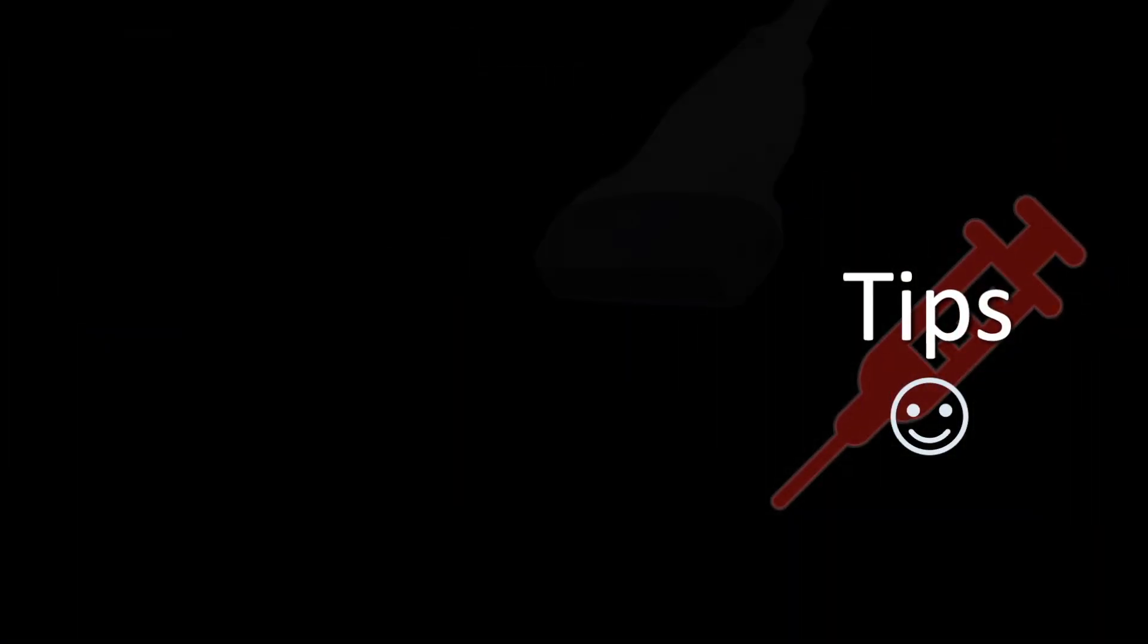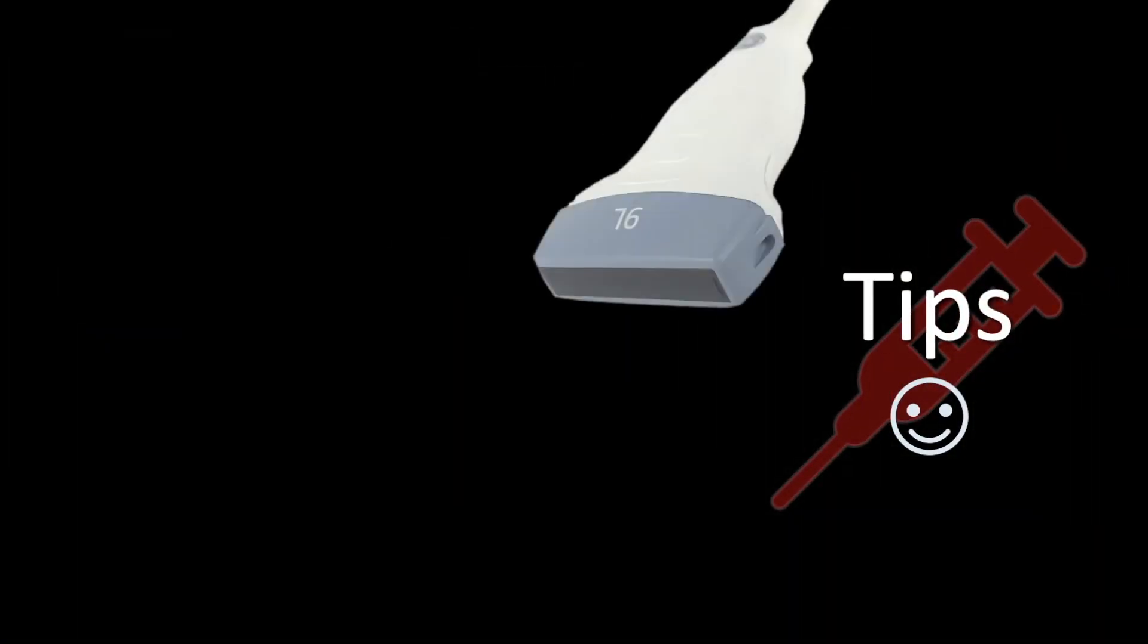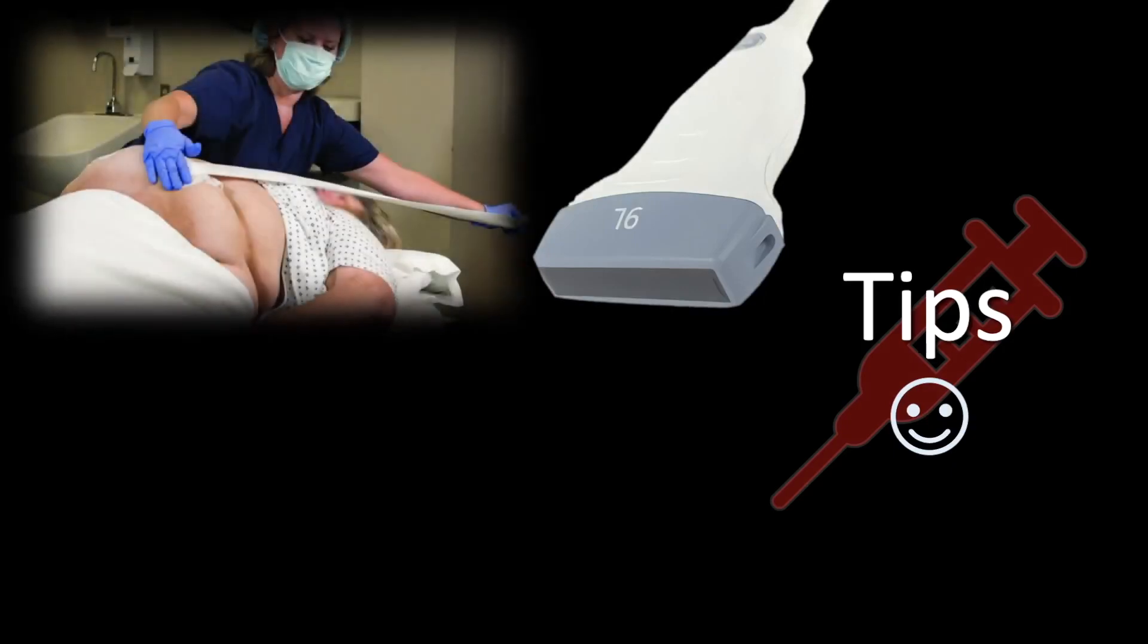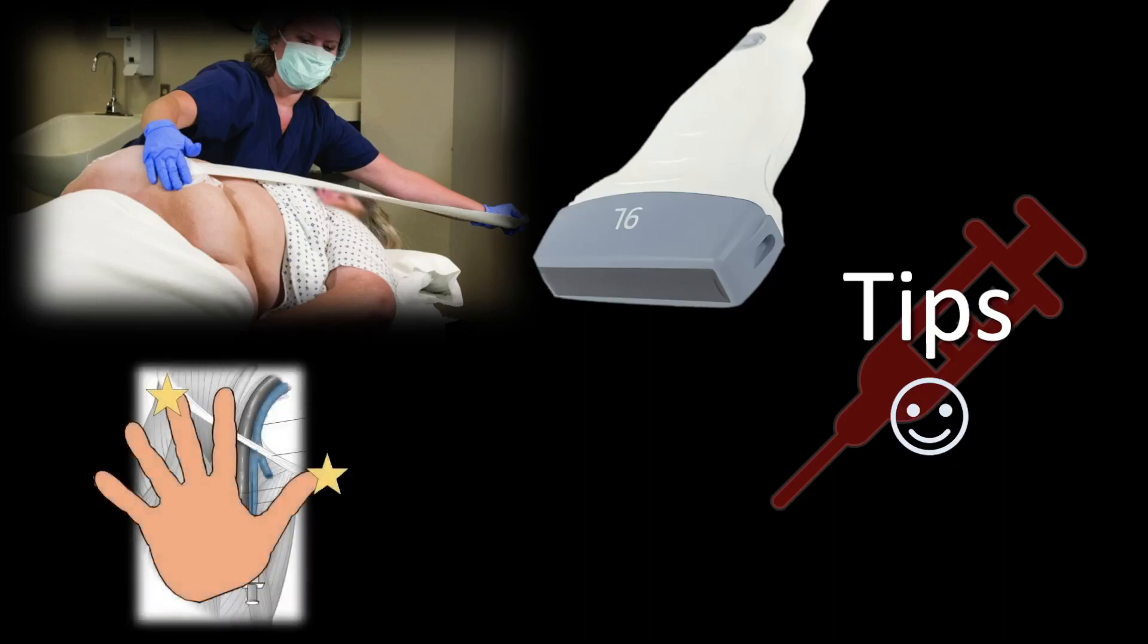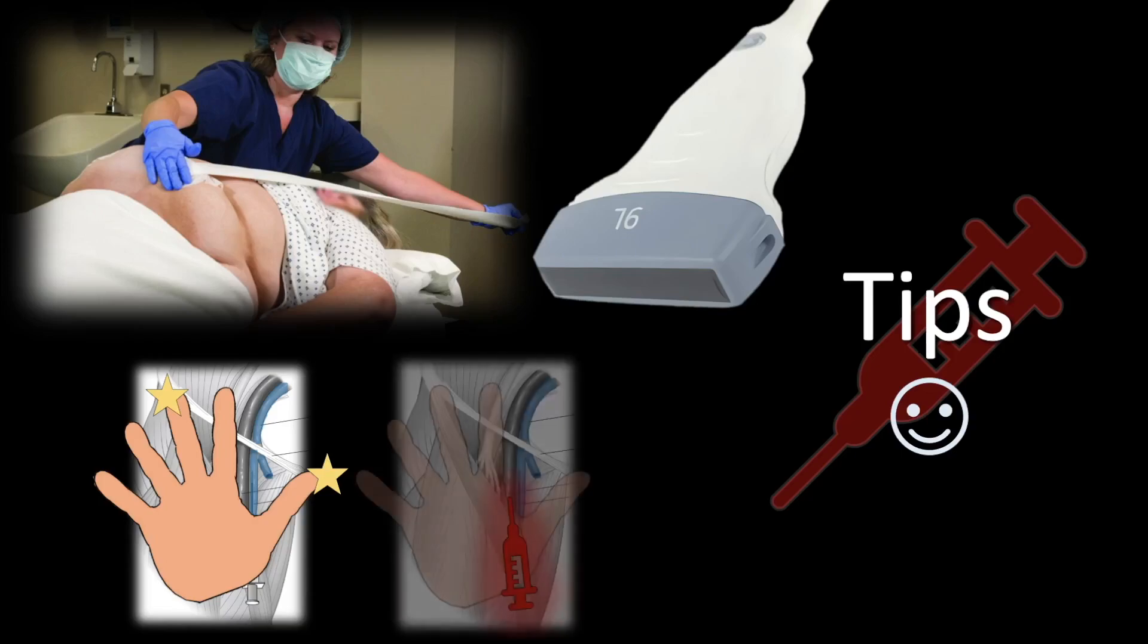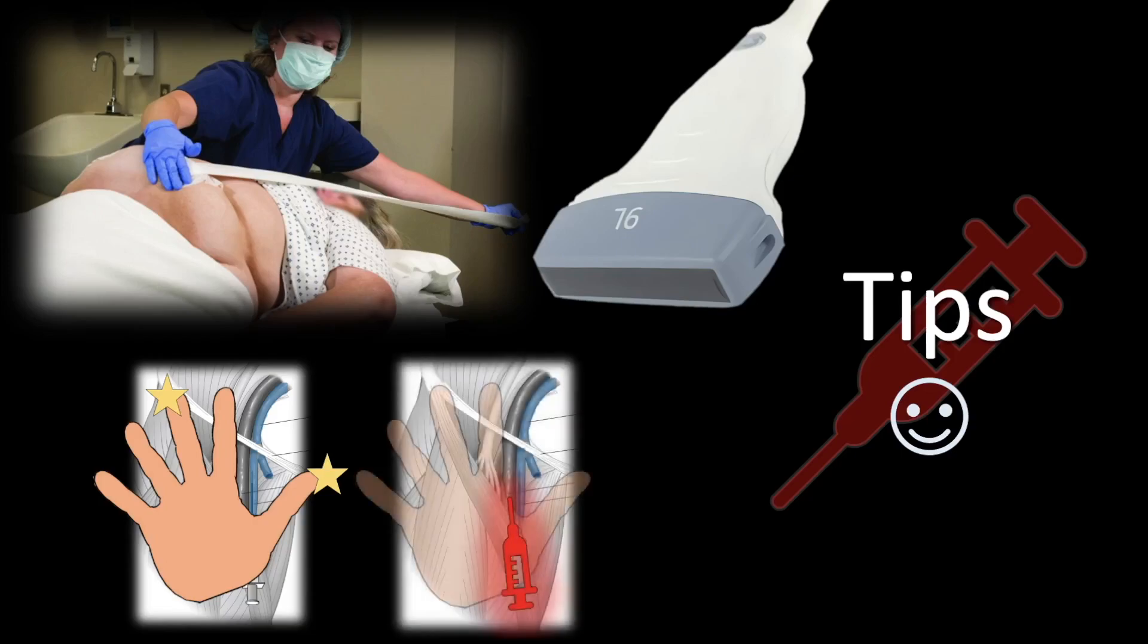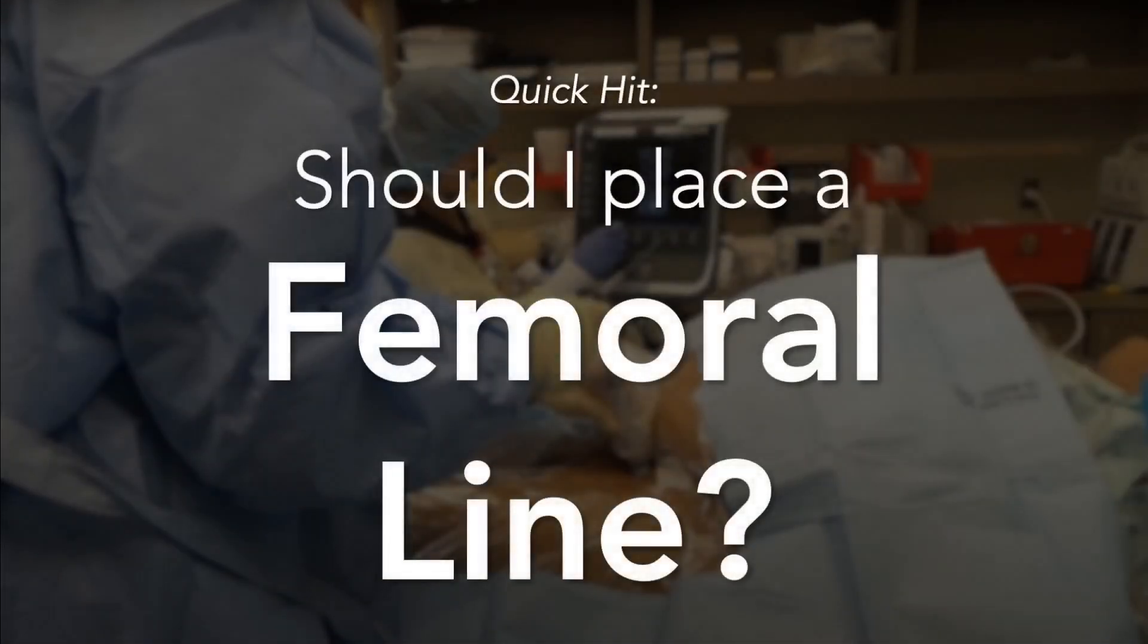And last, remember our four tips that we went over. If you've got the ultrasound nearby, just use it. Remember, it can be really tough to put these lines in obese patients. So position them well and use tape if you need. And then last, put your hand in that position we talked about to guide your needle insertion. If you're not using ultrasound for some reason, maybe someone else is using it during the resuscitation. And remember, if you hit artery, that's okay. Just throw in an A-line and then go back and cannulate the vein. Thank you guys so much for listening and good luck on shift.